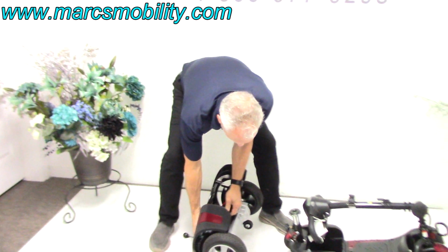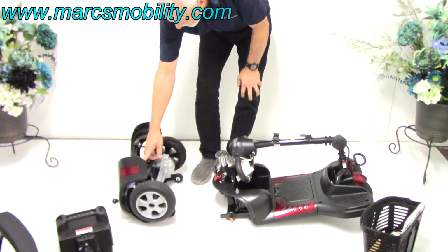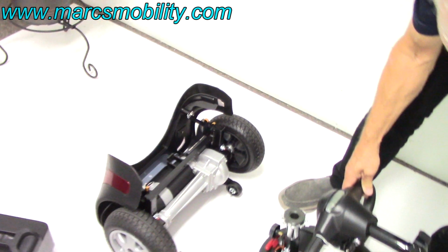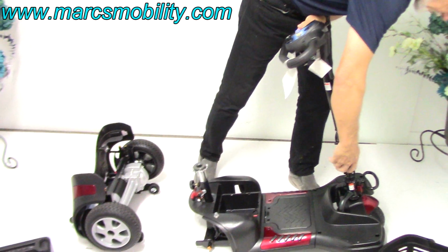So when you put it back together, sit it on its back like this. You can see where it's orange right here and right here. What you would do first when you put it back together is put your tiller back up so it's not in your way.